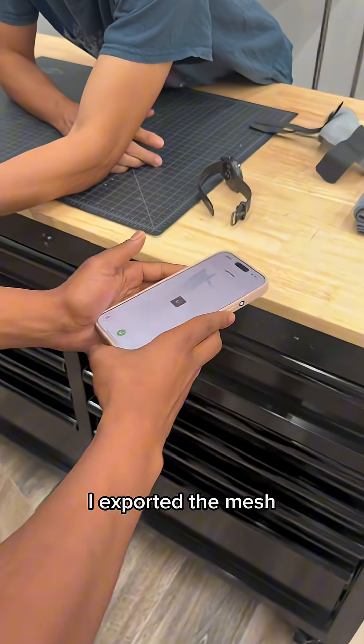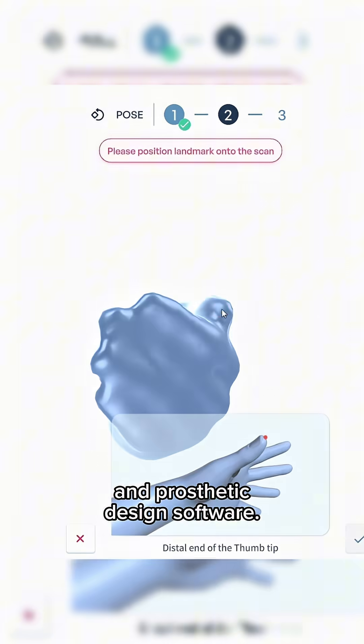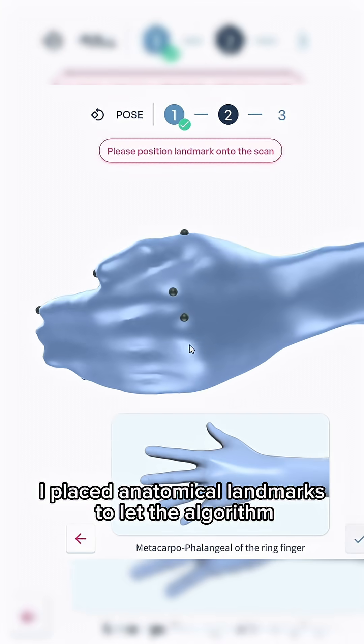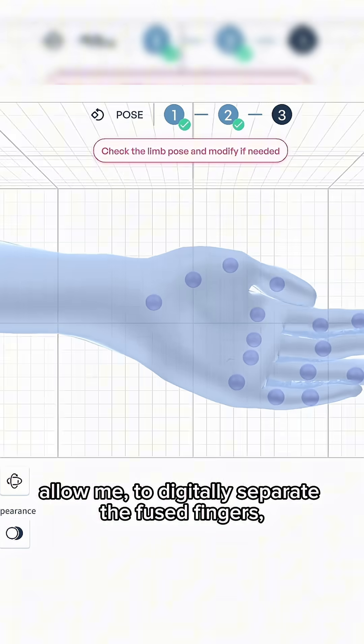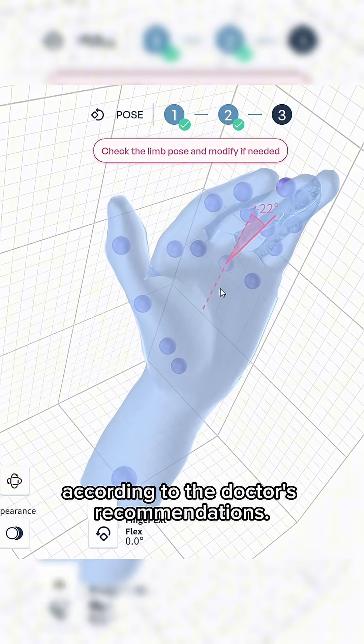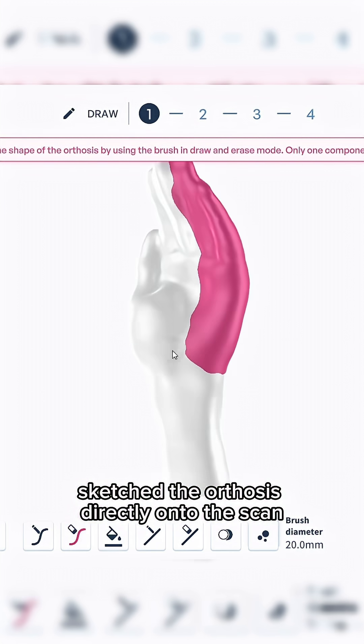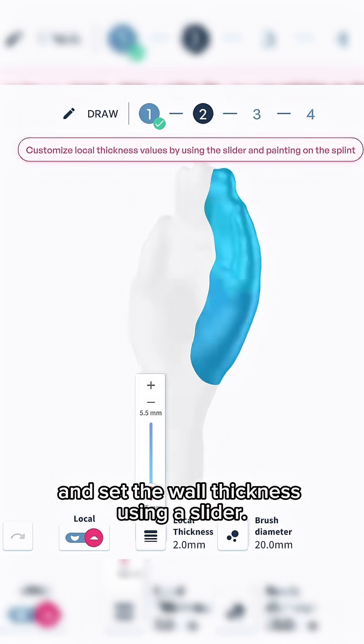After checking the scan quality, I exported a mesh and imported it into Spenty's orthotic and prosthetic design software. I placed anatomical landmarks to let the algorithm handle most of the work, allowing me to digitally separate the fused fingers with just a few clicks and reposition them according to the doctor's recommendations. Then I defined the offset with a brush, sketched the orthosis directly onto the scan, and set the wall thickness using a slider.